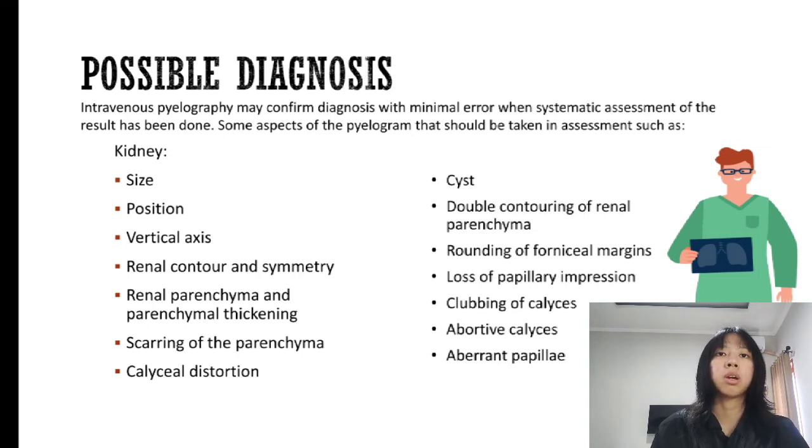I will explain about the possible diagnosis. Intravenous pyelography may confirm diagnosis with minimal error when systematic assessment of the result has been done.